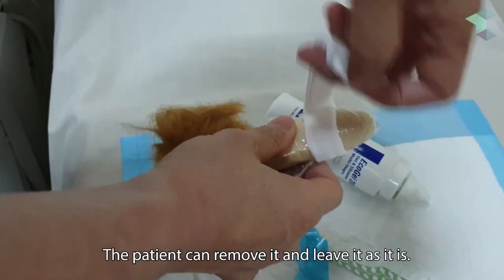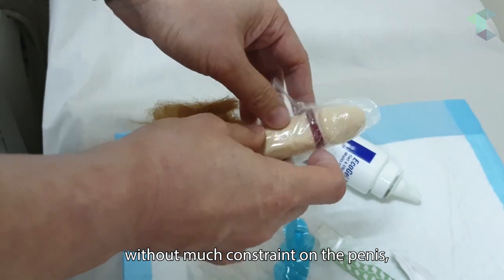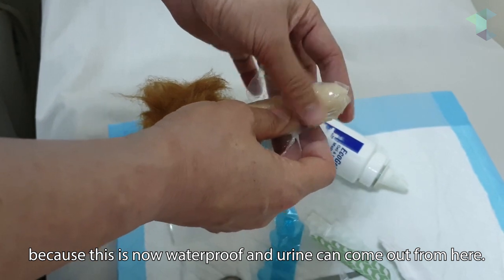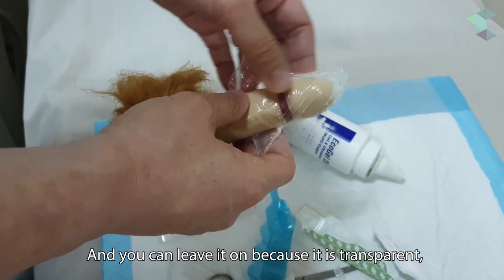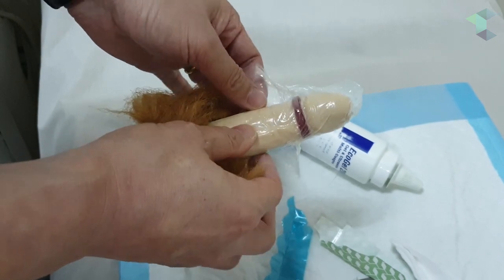The patient can have an erection without much constraint on the penis, and he can shower because this is now waterproof and urine can come out from here. You can just leave it on because it's transparent — the patient and clinicians will be able to observe how the wound is progressing.